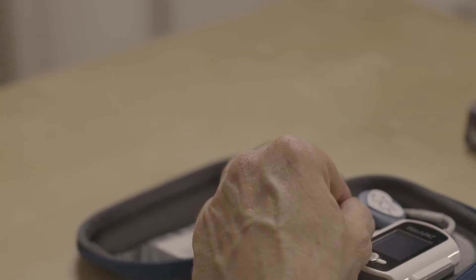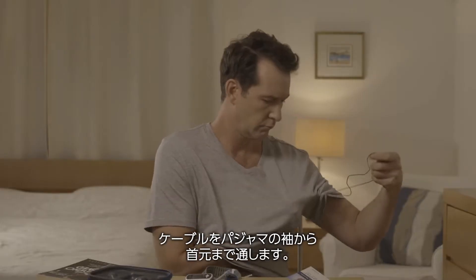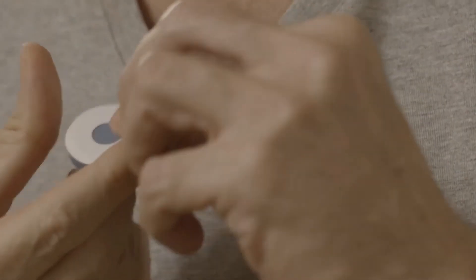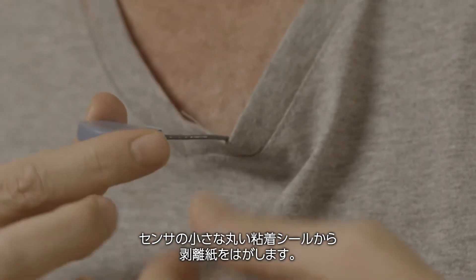This is the snoring and body position sensor. Thread the cable through your pajama sleeve up to the neck opening. Trim or shave chest hair if needed. Peel the backing from the small round sticker of the sensor.